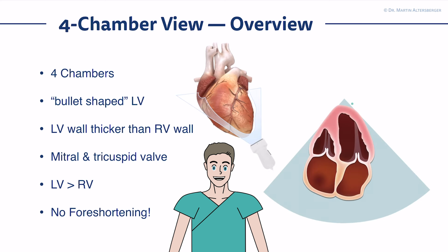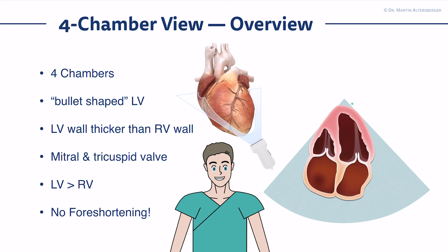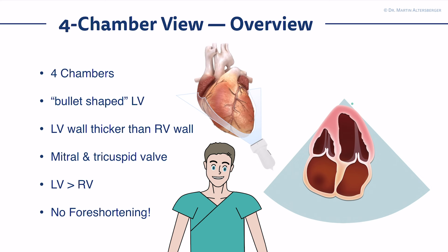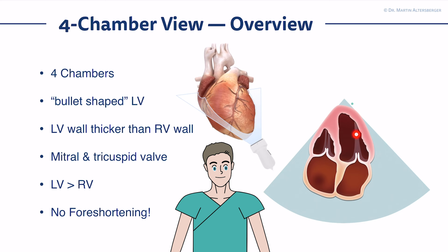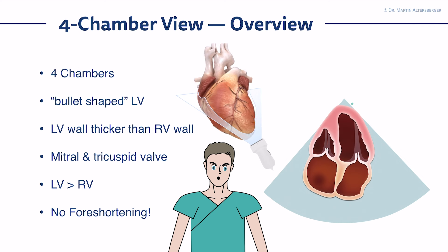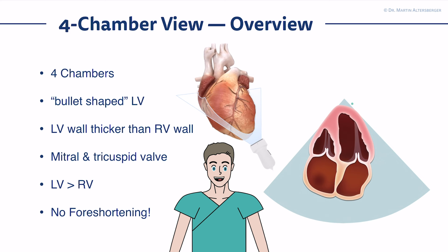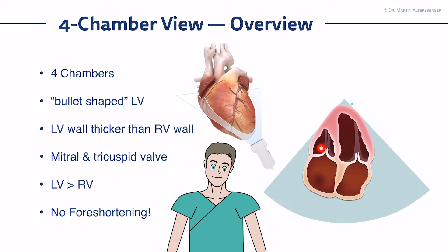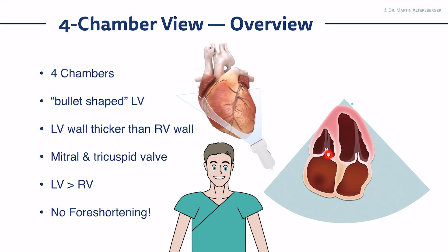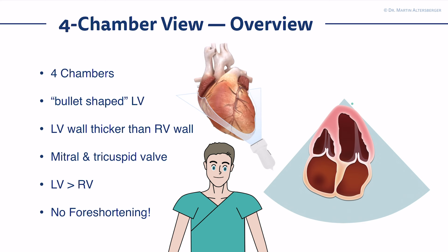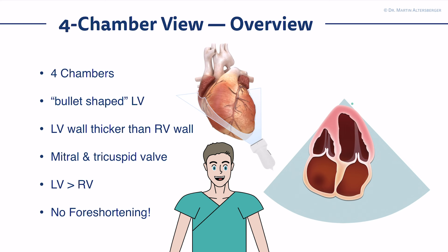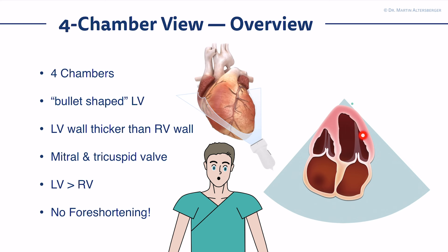In the four chamber view, you get an overview of all four cardiac chambers. The left ventricle should be bullet-shaped, and the left ventricular wall should be thicker than the right ventricular wall due to the pressure difference between those chambers. You also need to identify valvular structures: the anterior and posterior leaflets of the mitral valve, and the septal and anterior-posterior leaflets of the tricuspid valve. The left ventricle should be larger than the right ventricle — overall approximately a two-to-one ratio.